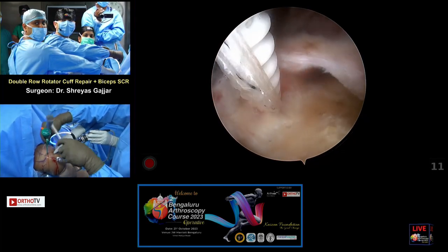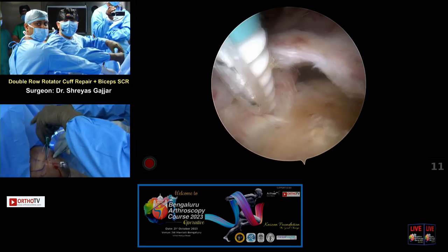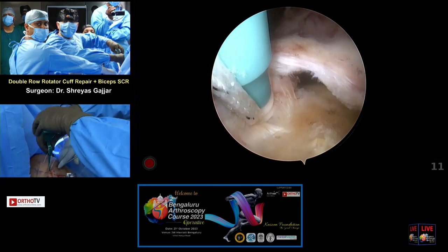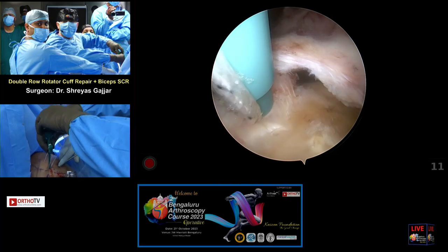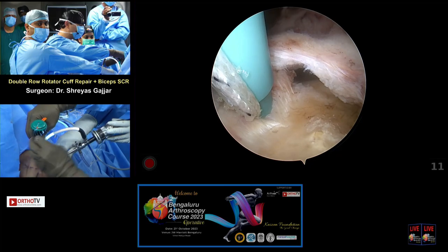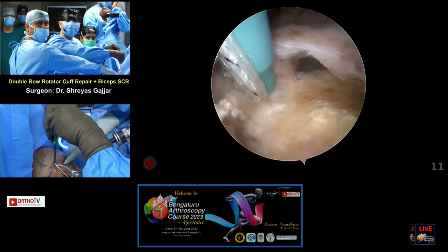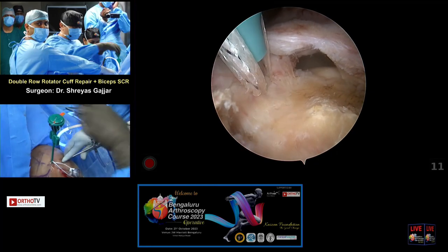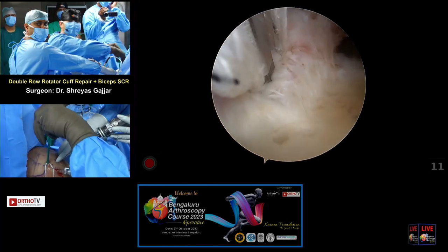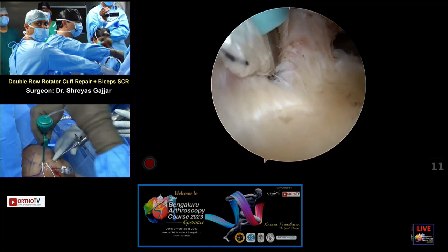Once the anchor reaches the tip of the bone, hold the thumb pad and then just screw it in till it is flush with the bone. Here, because the tapes are attached to the anchor, you have to undo the tapes before you withdraw the thumb pad to see how much your anchor is flush with the bone. Then we just take it off.